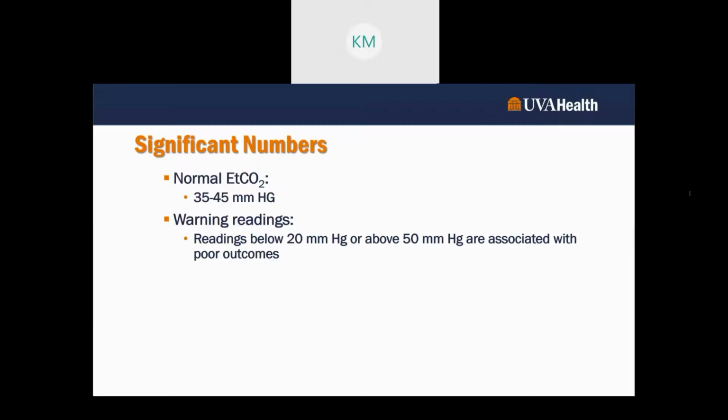But I do want you to keep in mind that end-tidal CO2 is a tool here, okay? And the tool is only as good as the person who's using it. So you need to keep in the back of your head that this isn't going to be perfect. You can't just say, okay, the patient's end-tidal CO2 is 32, that's bad, I have to act on it right now. You have to look at your patient and say, why is my patient's number reading that way? Because there are some things that may make a slightly low or slightly high number okay.